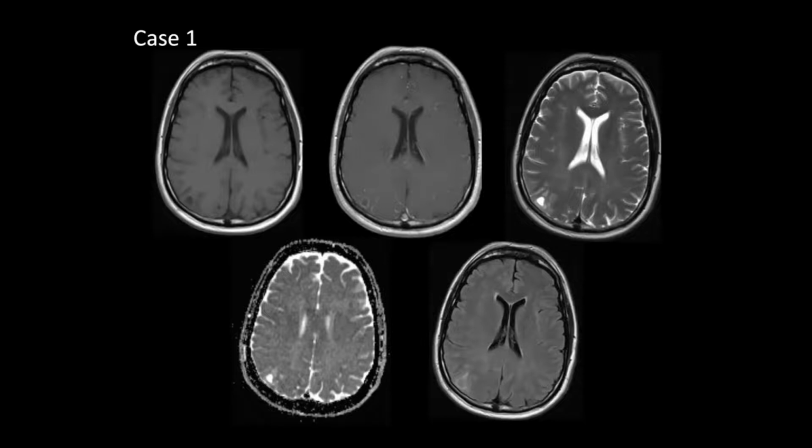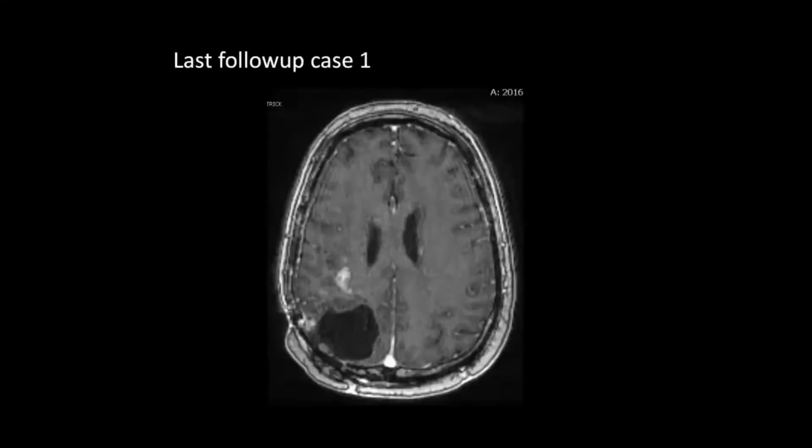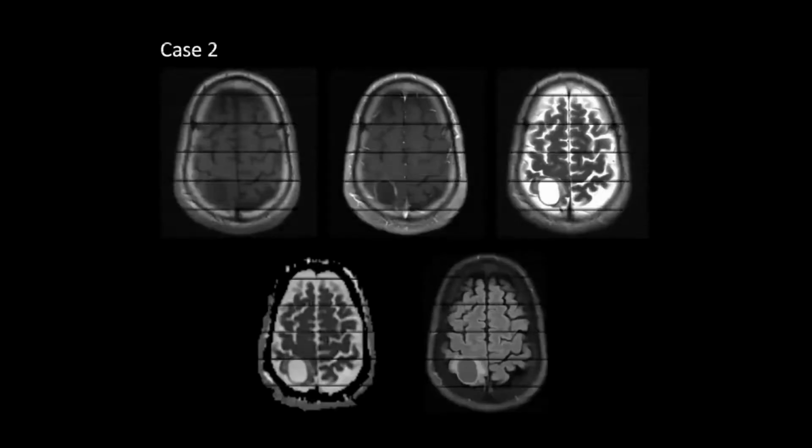So this lesion is much worse than the previous one, just because even if it is small, there is infiltration in the brain parenchyma. So there is no possibility of removing the entire lesion. Indeed, on follow-up, we saw that there is some recurrence here, because even if we resected maybe more parenchyma of the brain, there was no possibility of avoiding infiltration of the tumor.